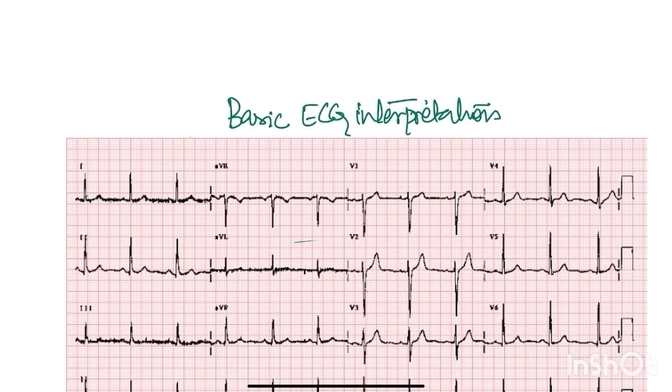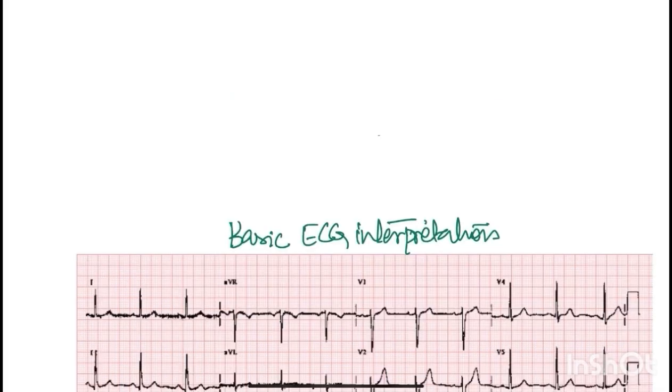So I won't be discussing the technical aspects of it, how each wave is generated, and all that mechanics, but rather I would be limiting my discussion to the interpretation of an ECG. So what all observations can we make from an ECG?